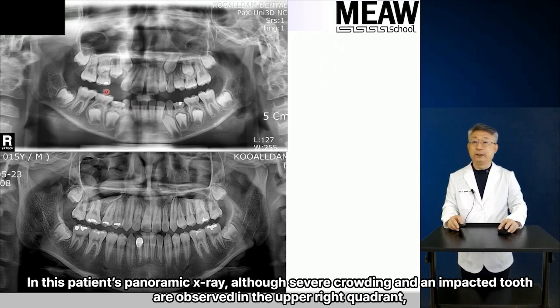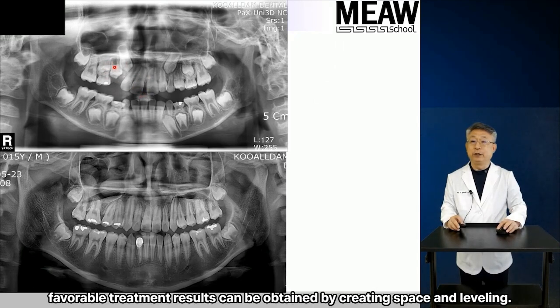In this patient's panoramic X-ray, although severe crowding and an impacted tooth are observed in the upper right quadrant, favorable treatment results can be obtained by creating space and leveling.